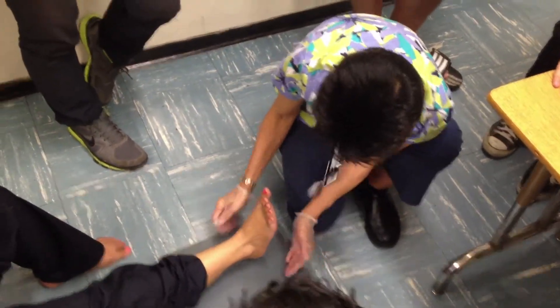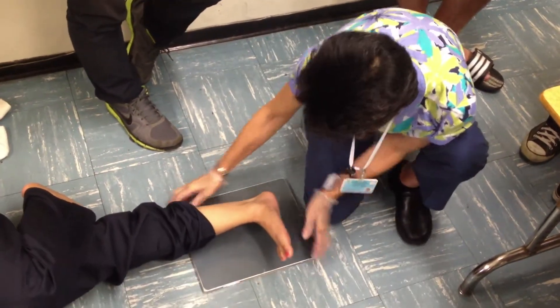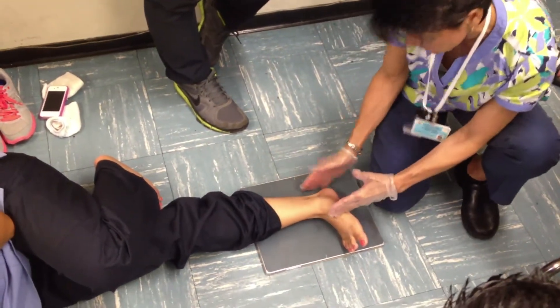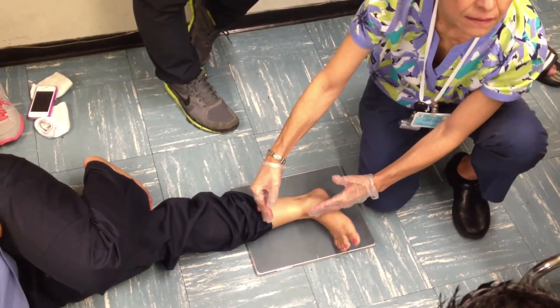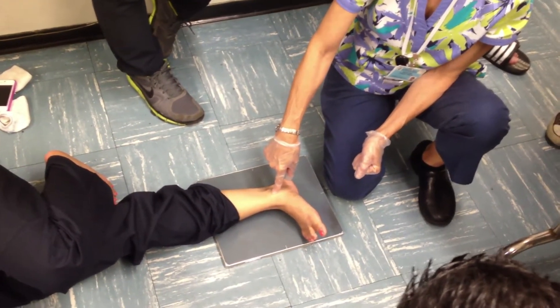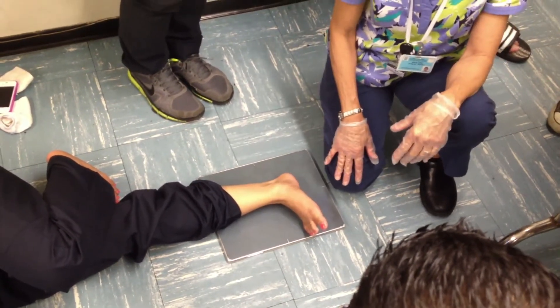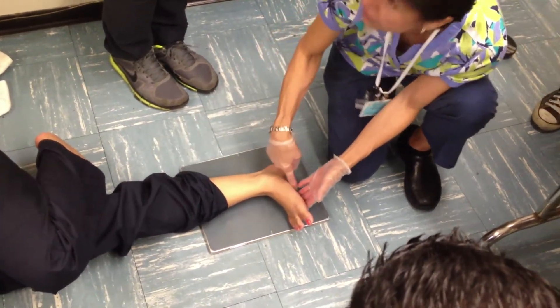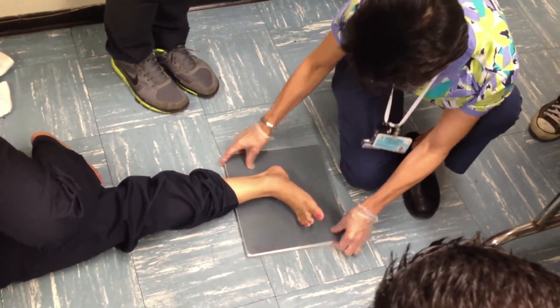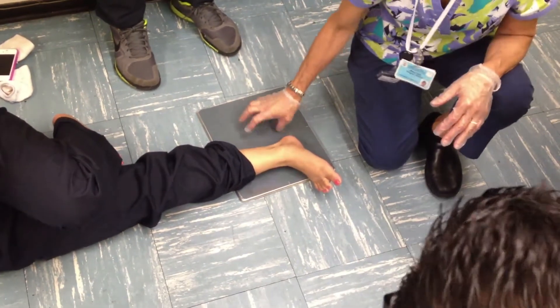Lift up, please. Turn over on your side — lateral ankle. Dorsiflex. Palpate malleoli to be superimposed. CR and collimate. You don't collimate here — you collimate from here to here to here. Lateral ankle, lateral heel, lateral foot — it's all the same. It really is all the same. It's just knowing how to move this and where your CR is going.